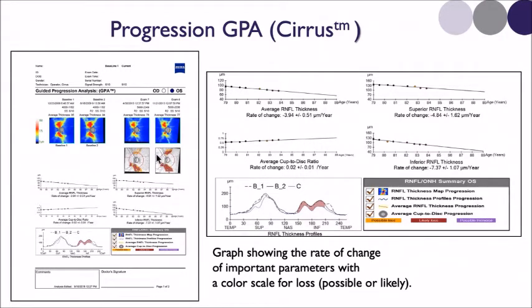If the progression had been a dot over here, that would have been less likely. Here you see an area that has become abnormal or has changed for the first time. Here in the red and orange are areas that have changed over multiple visits, and the orange is where it's only changed for the first time. Any of these areas of change that we're looking at are compared to the two baseline exams. So it's an event analysis.